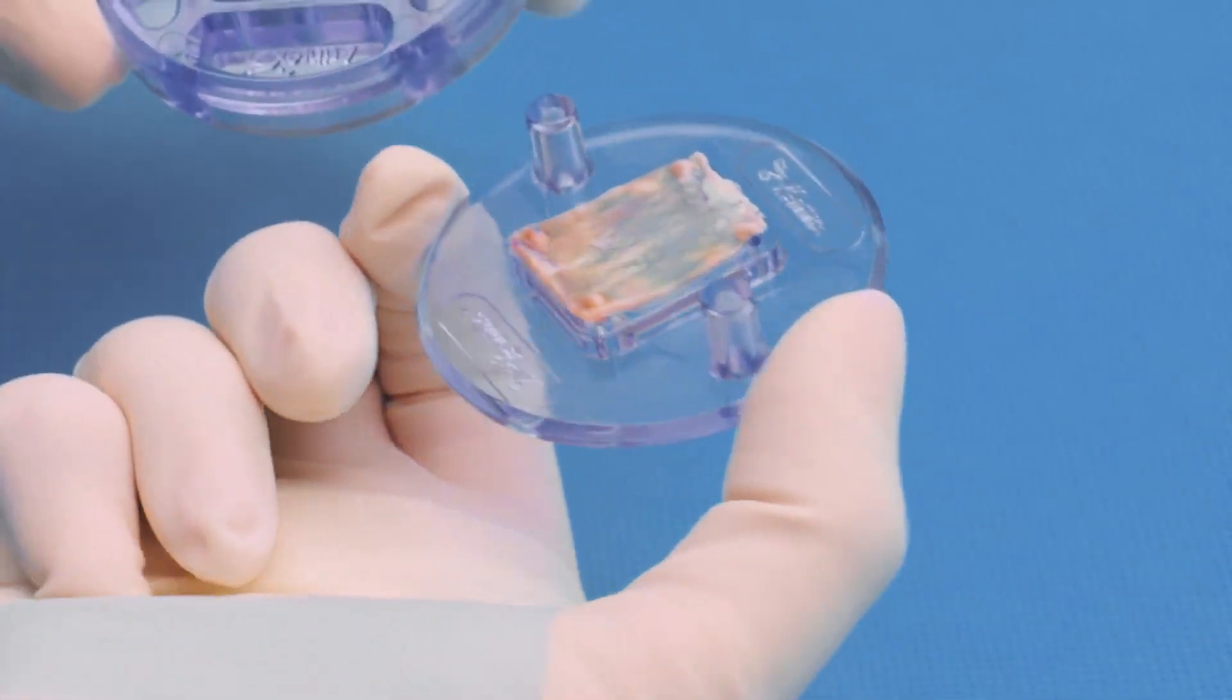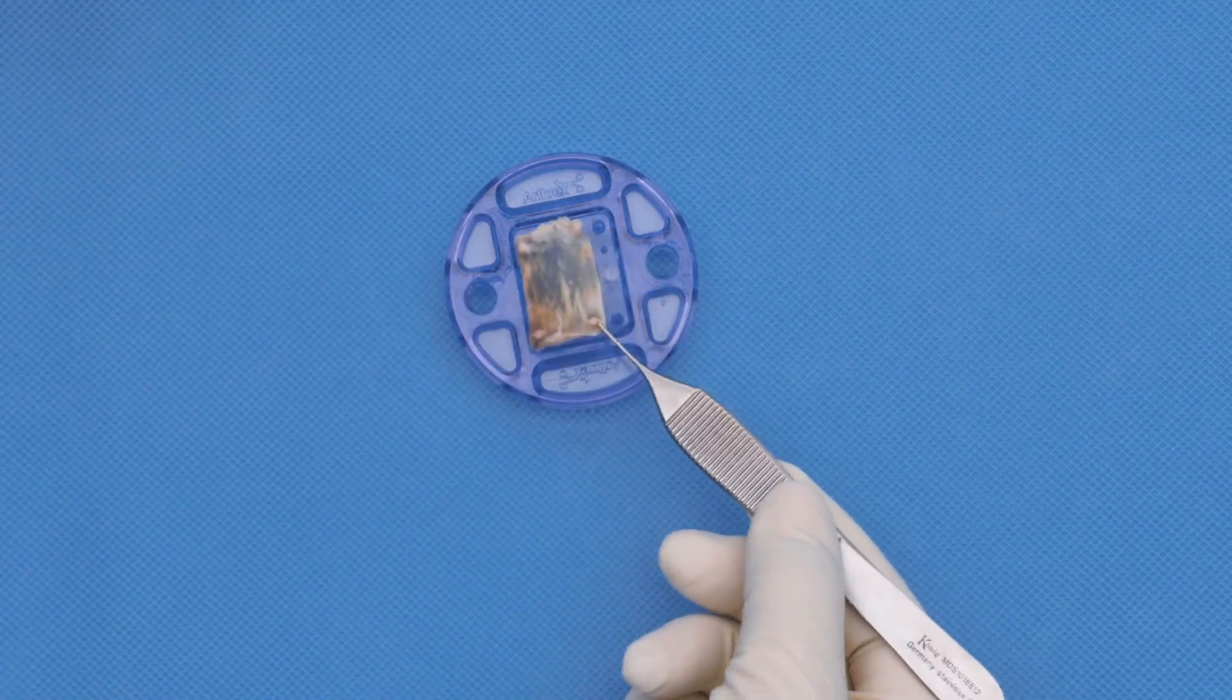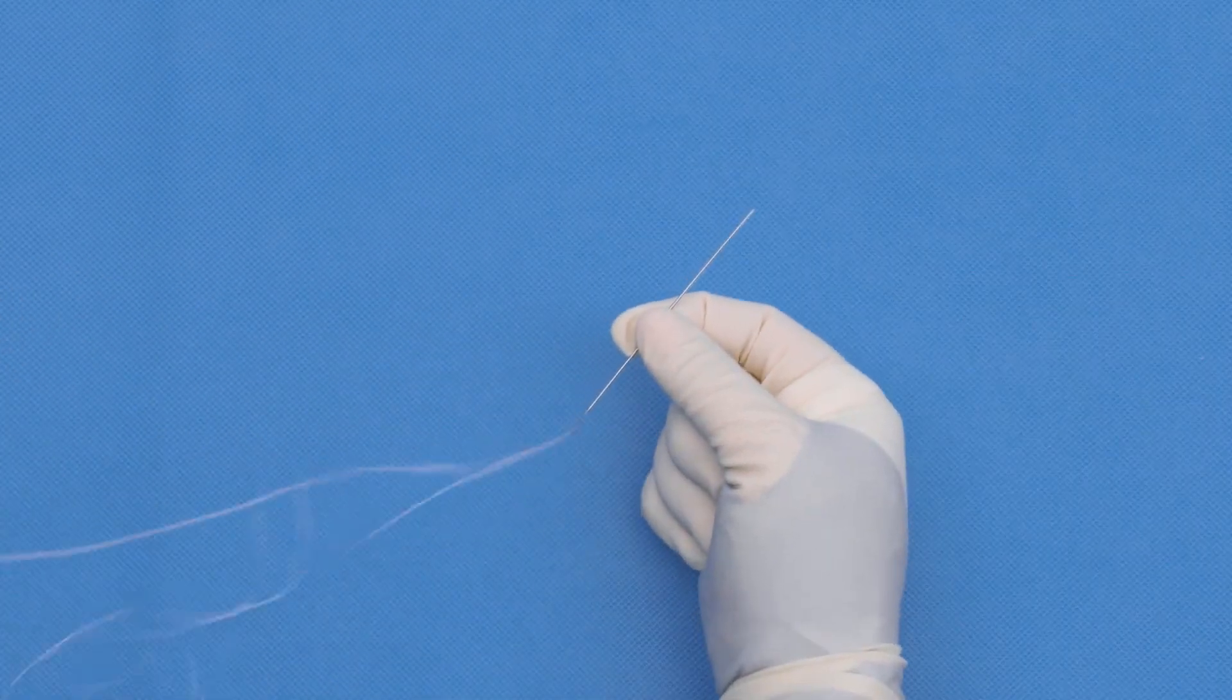If the graft is stuck to the top plate, move it to the bottom well to allow for easier suturing. The plates have 4 holes for suture passage. For the medial sutures, a fiber loop can be used.